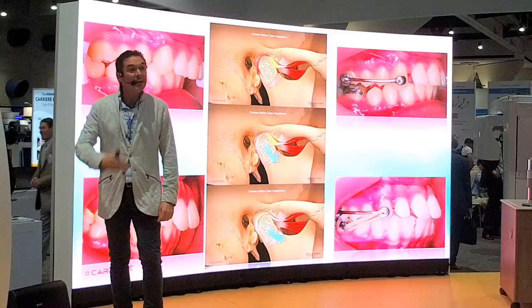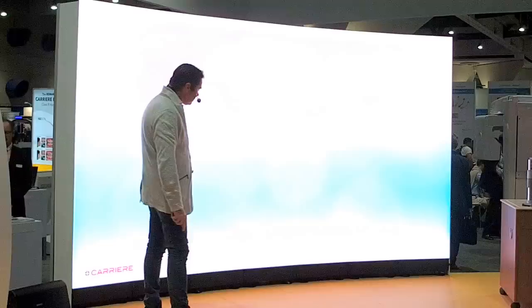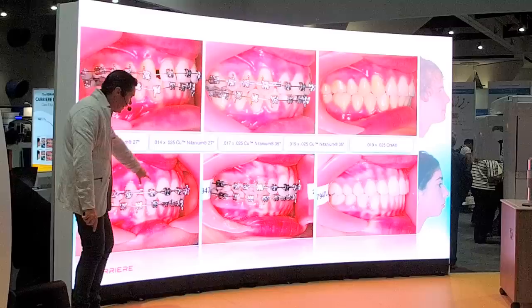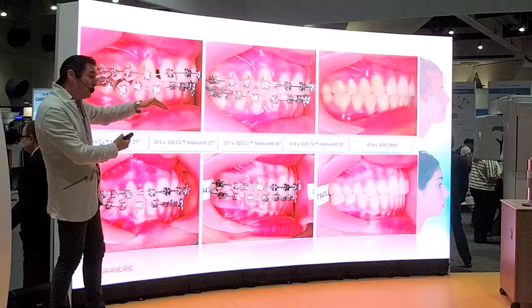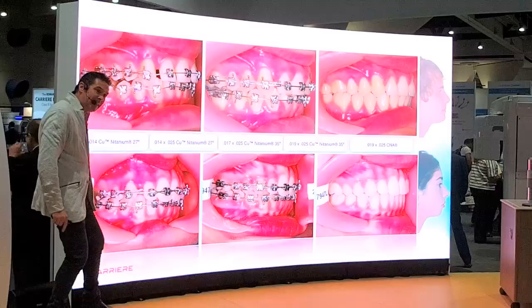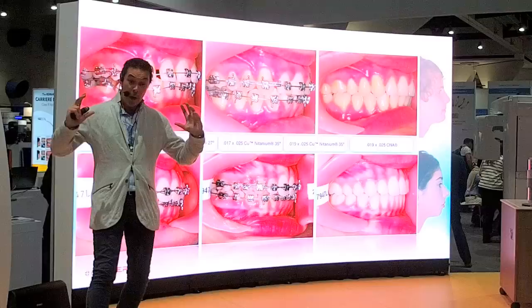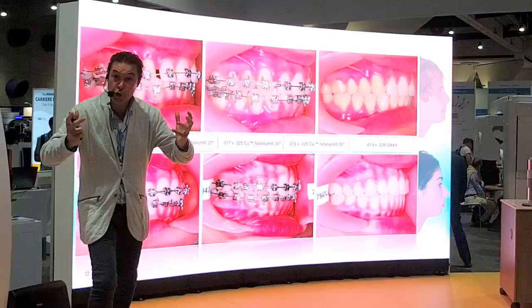The relation is much better at the joint level. Once we accomplish the class 1 platform, we switch to the SLX bracket, follow the archwire sequence, and end up the case. Once we accomplish the class 1 platform, we place the SLX bracket and bring everything in place. When we do the retraction of the anteriors, we must make sure we never attach the power chain on the molar — only on the five, four, and hook. Because attaching the power chain on the molar would rotate it forward and we lose the nice distal rotation accomplished with the Motion.